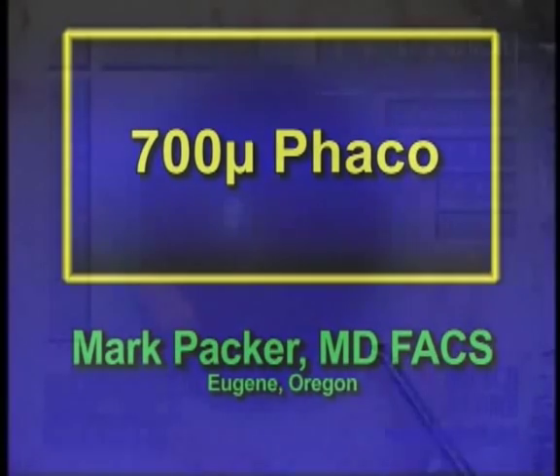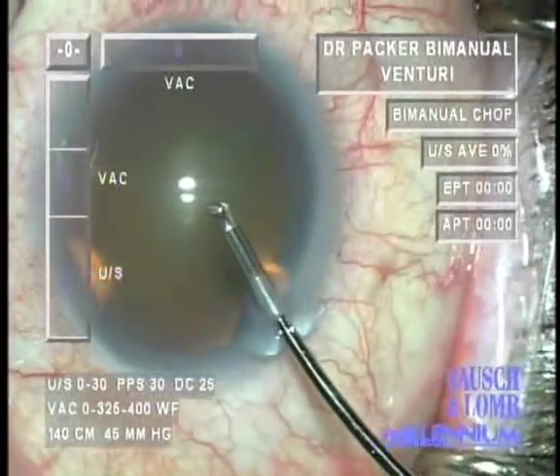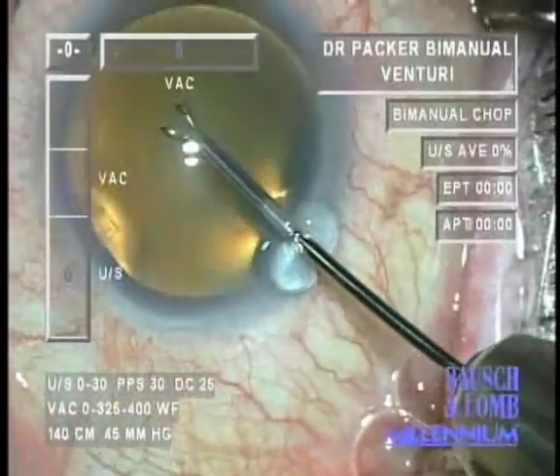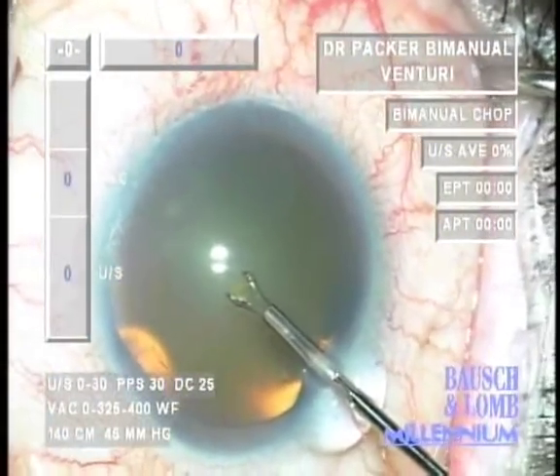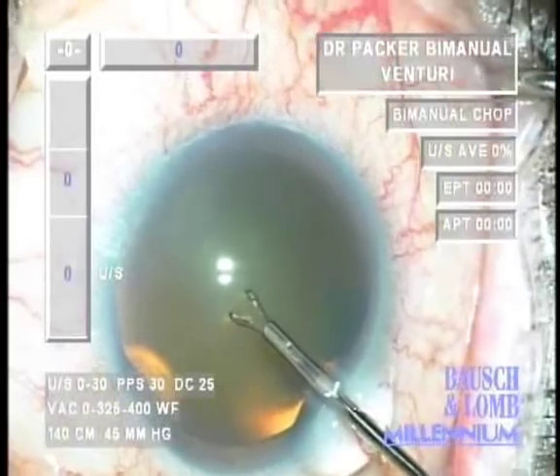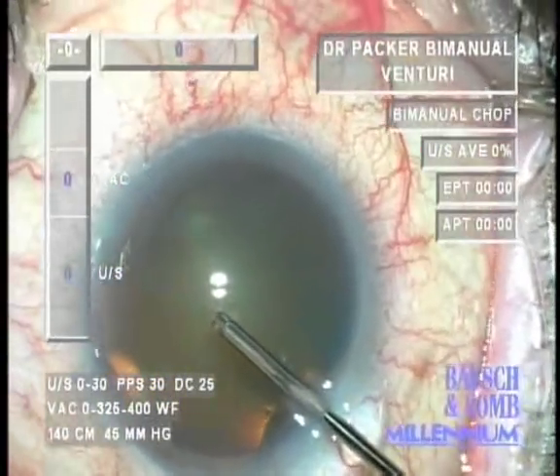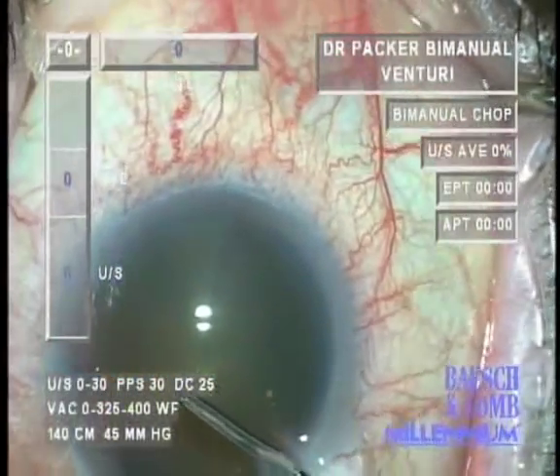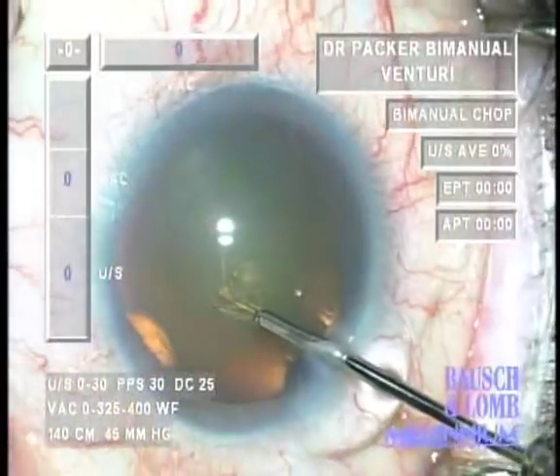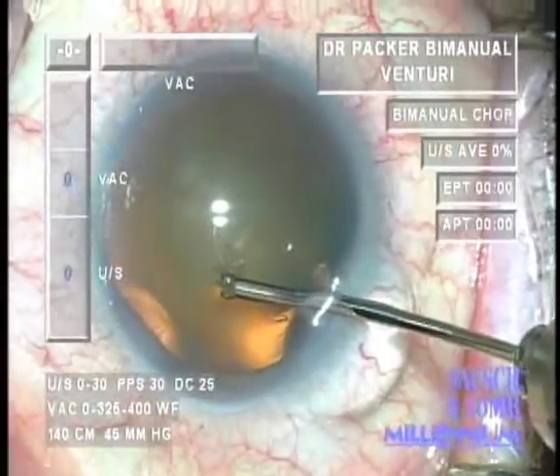Bimanual or biaxial microincision phacoemulsification is not just about the size of the incision. It's really more about increasing control and efficiency during surgery. So when we've reduced our incision size from 1.5 to less than 1 millimeter, it's not simply because we think smaller is better — it's also because increased control can be an advantage during surgery.